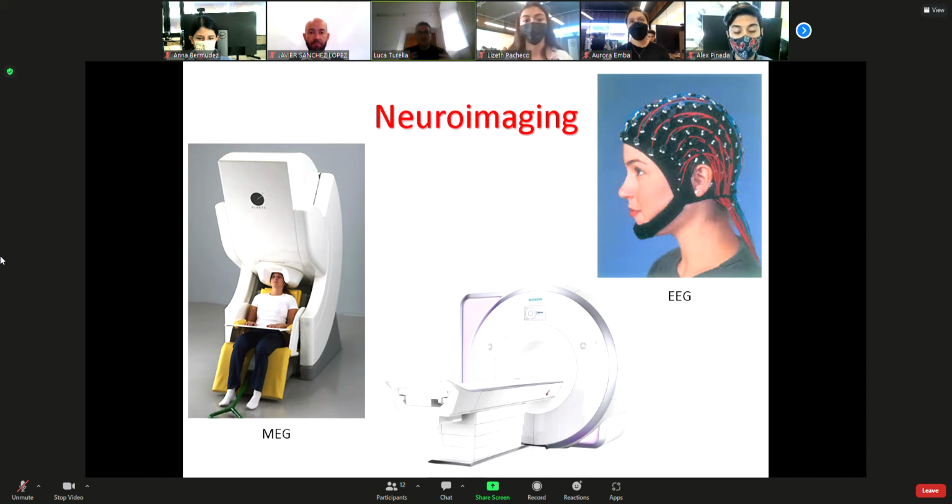And so I also have a unique idea of how to compare these different types of techniques one to the other. As I said, and probably you already know, the main difference between the MRI and EEG, MEG is based on the type of information they give us. This will come also later: MEG, EEG has a very high temporal resolution, so it allows you to see how the brain processes information at the level of a millisecond, whereas functional MRI cannot show that.